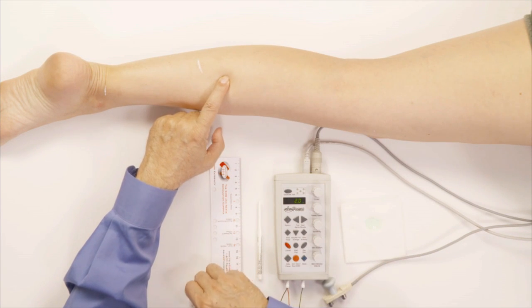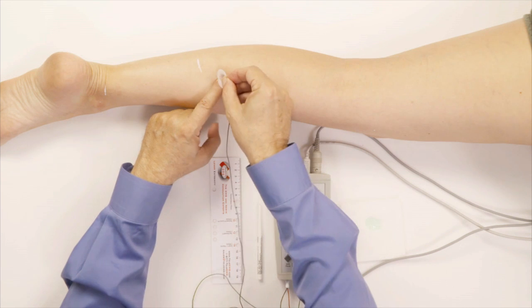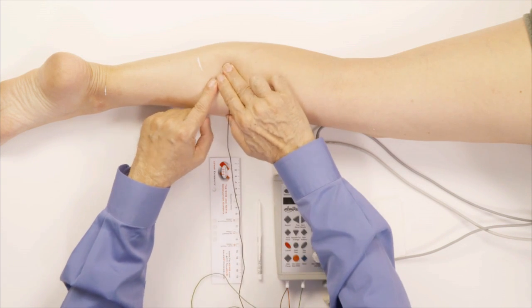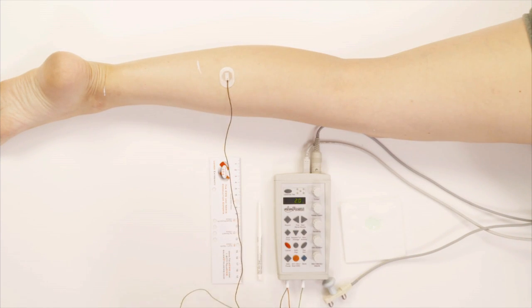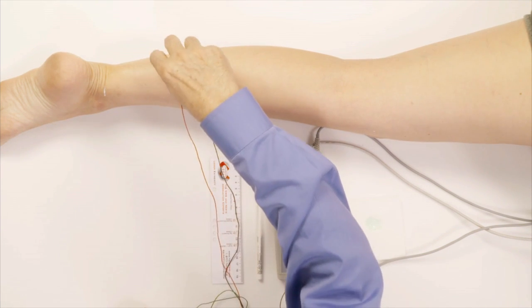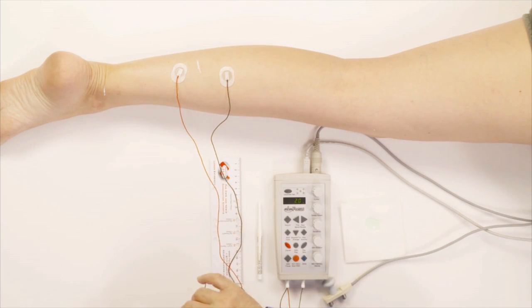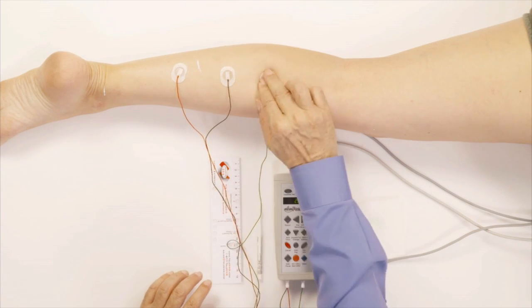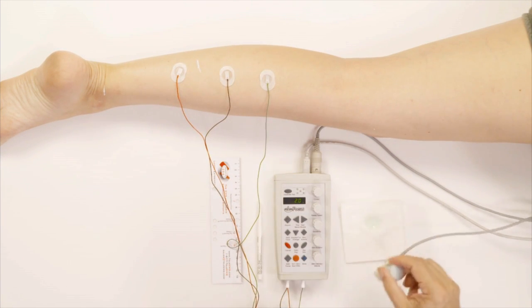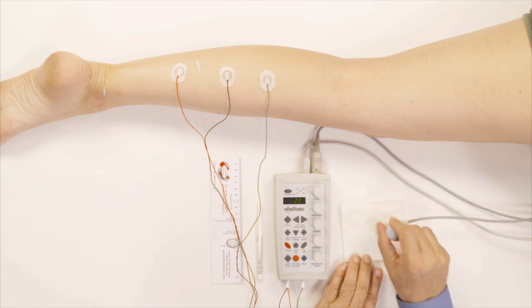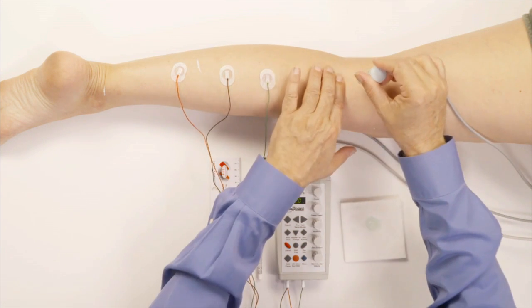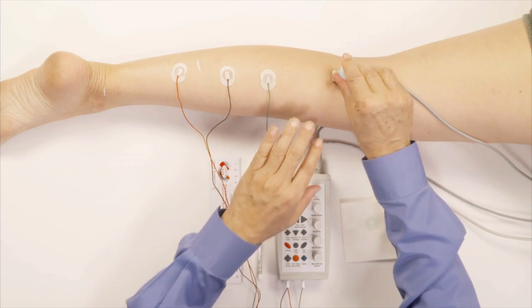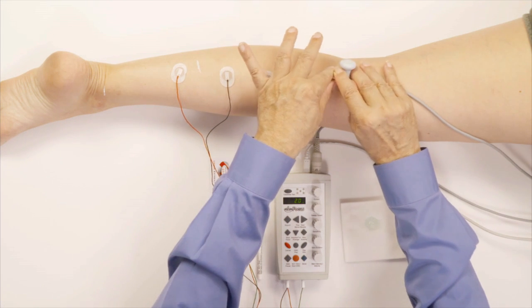That's where I will put my active black electrode. And as usual, the reference electrode is going to be below it right there, and then the green ground electrode is going to be somewhere here. And now I can put the cream and I'm going to stimulate the tibial nerve right here at the knee. These nerves are deep, so I usually have to use higher stimulation intensity.